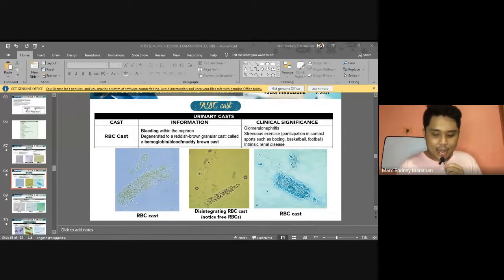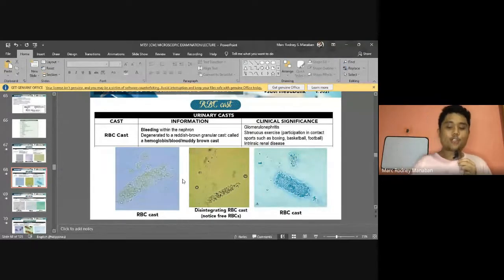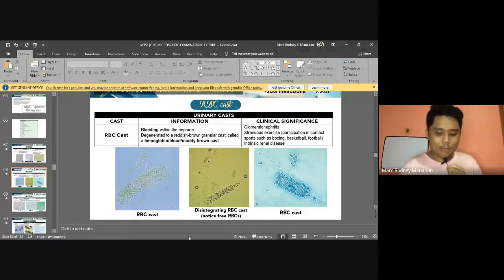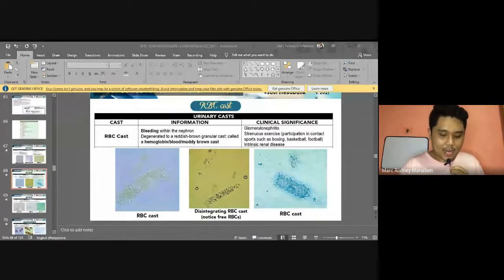Okay? Alright? And aside from that, it can also be seen in strenuous exercise, especially those that involve contact sports, such as boxing, basketball, or football, because there could be possible injuries to your abdomen or wherever, which can cause the introduction of RBCs to your urine, and of course intrinsic renal disease. A possible problem not only in the glomerulus but also in the other parts of your nephron. Okay, all right.